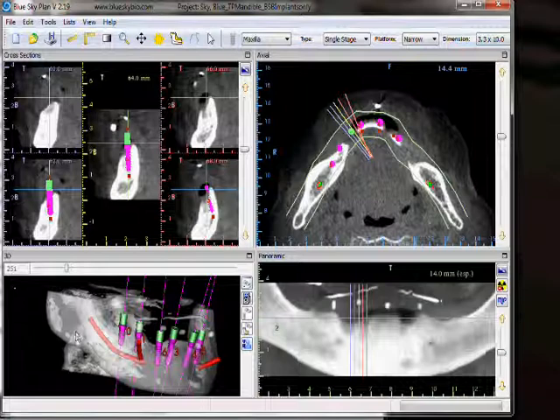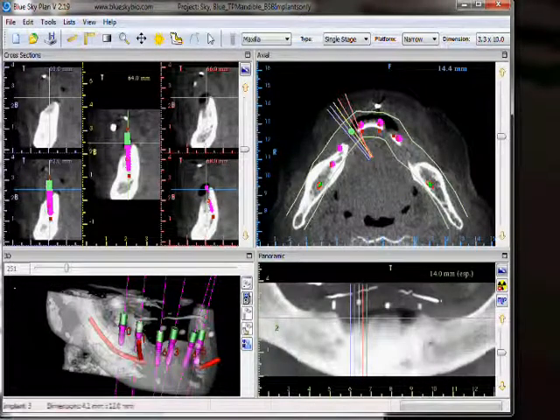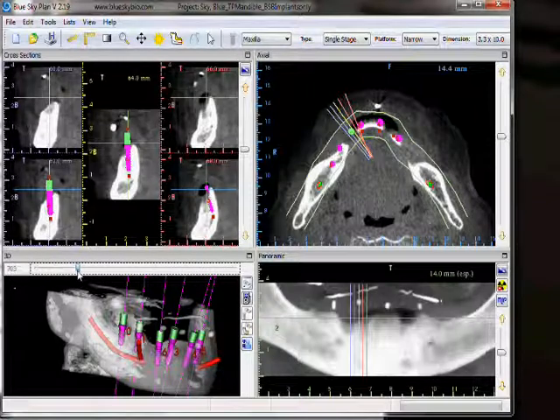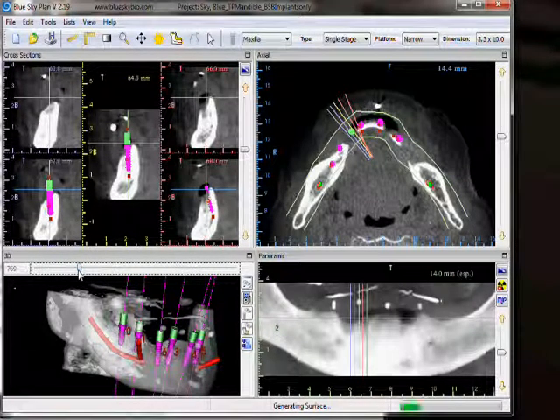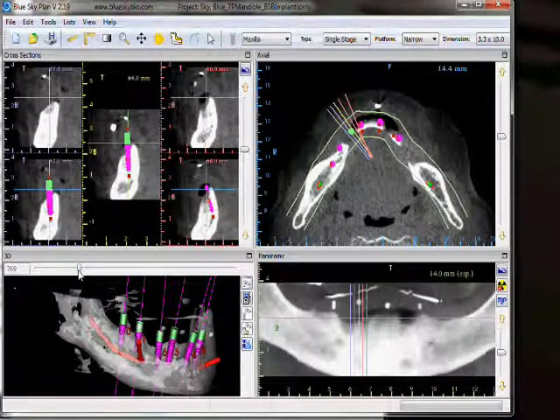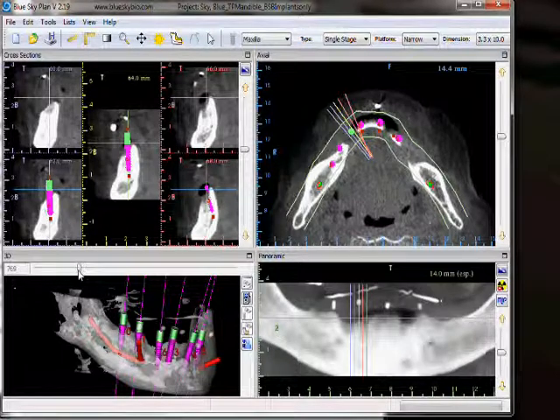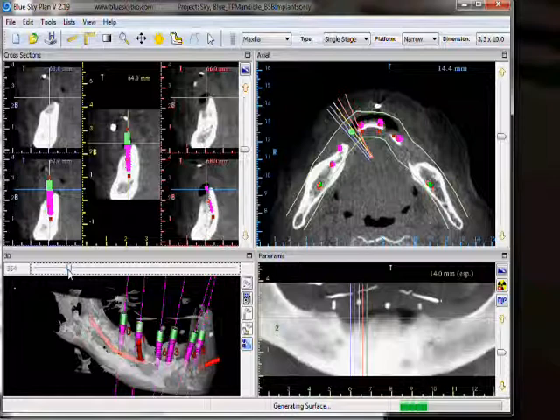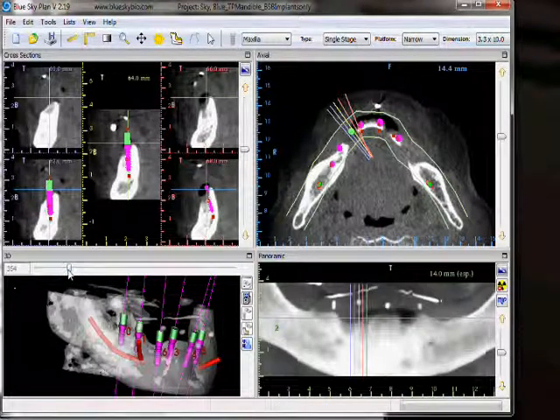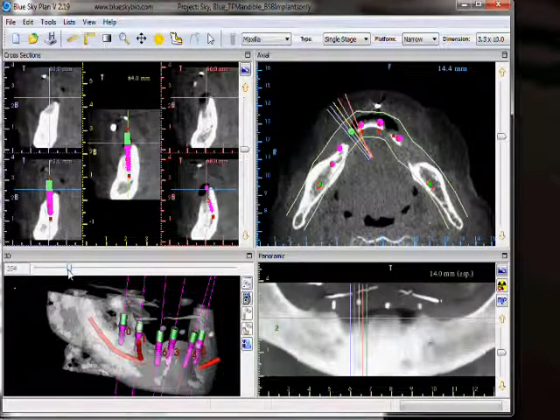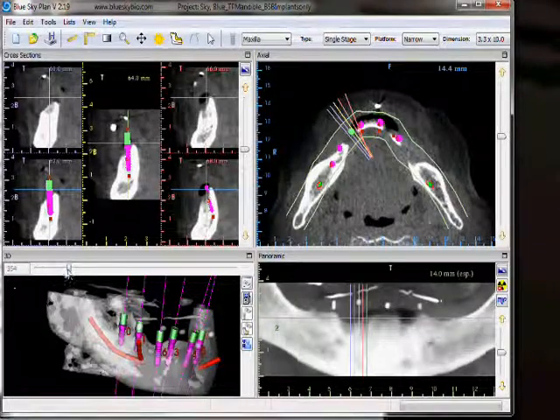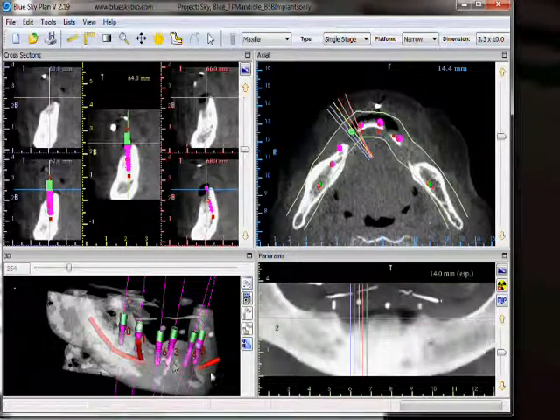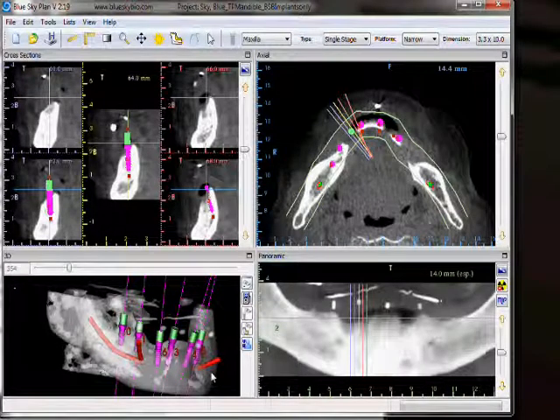We have our 3D image. The slider on the top is our 3D density threshold. As we raise the threshold, we see less anatomy — only the more dense anatomy. As we lower the threshold, we see more anatomy, including the less dense anatomy. For complete information on how to use the 3D view and all of its functions, please watch the 3D tutorial.